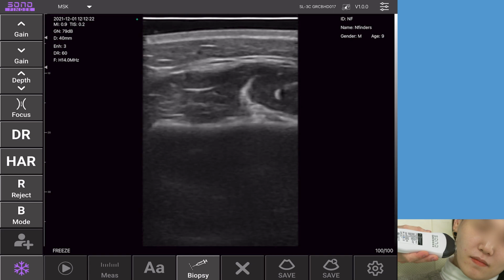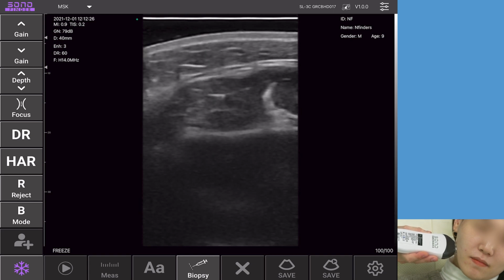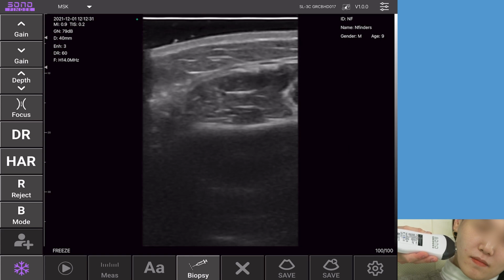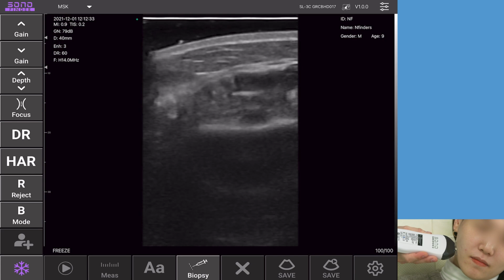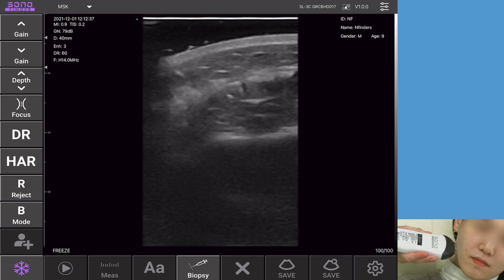The masseter muscle is seen as a hypoechoic structure with some tendons, lying over the ramus of the mandible. The presence of the deep inferior tendon is important, because it is believed that it can restrict the diffusion of the toxin between the deep and superficial layers.